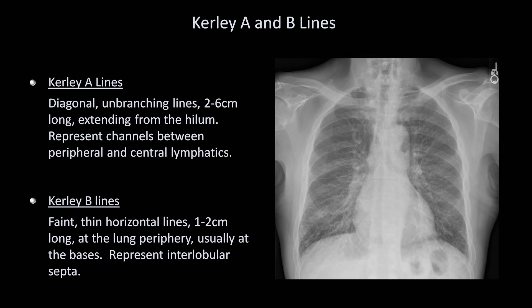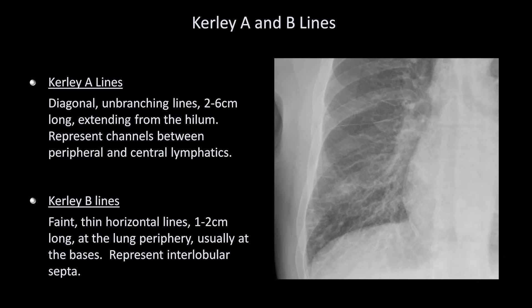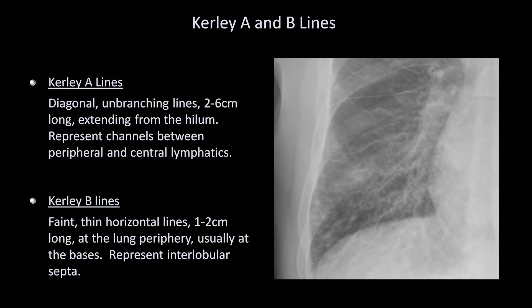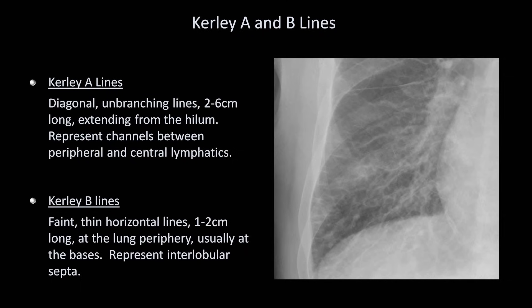In this example, if we zoom in at the right lung base, we can see the tiny, faint horizontal curly B lines, specifically indicating this patient may have mild heart failure.